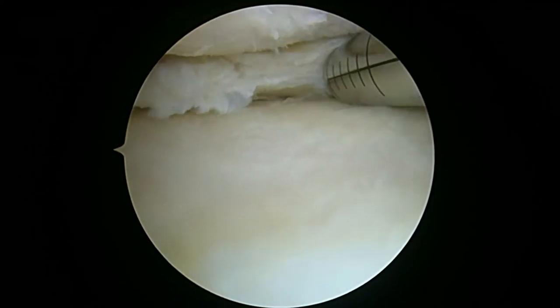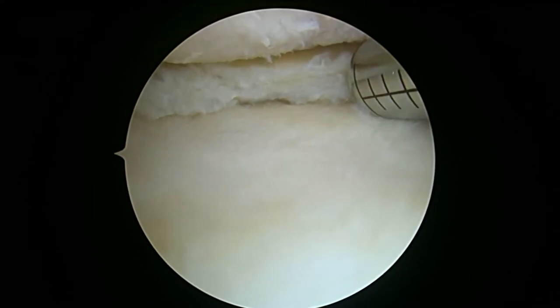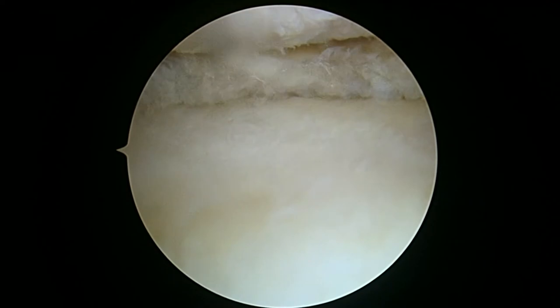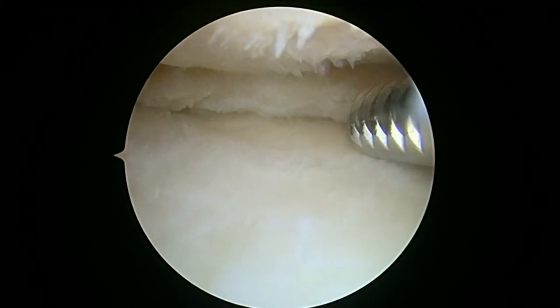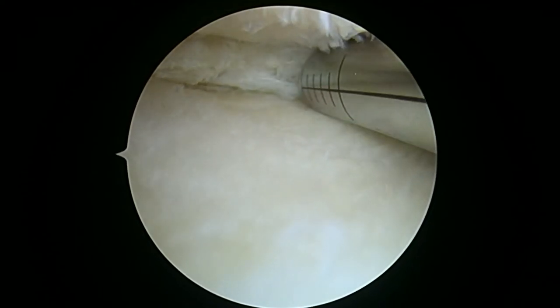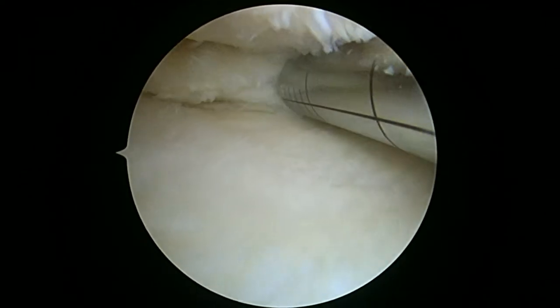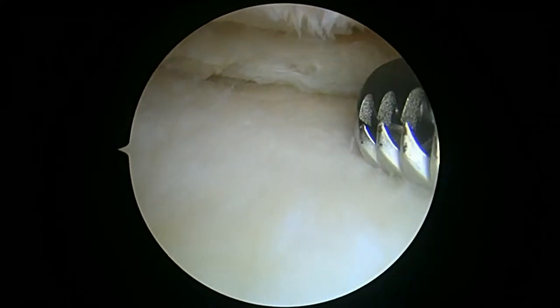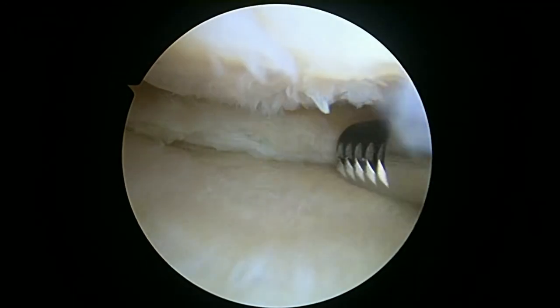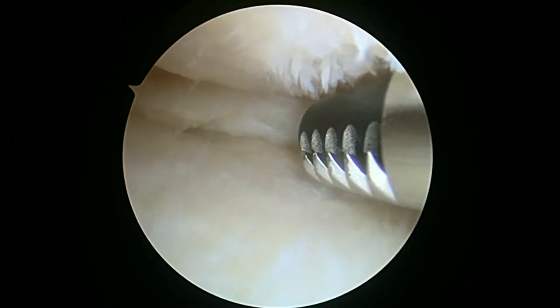So you can see we've still got a little bit more work to do to get that smoothed up here in the back. Okay, so we're just finishing up on this posterior horn. Again, we don't want to take out any more than we have to. I just wanted to show you what we're doing here. So we're getting there, just a little bit more, but at least now that rough edge is already taken care of.